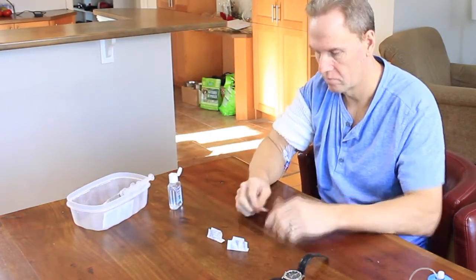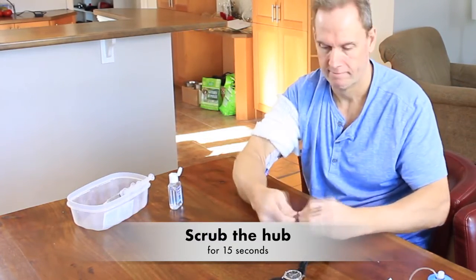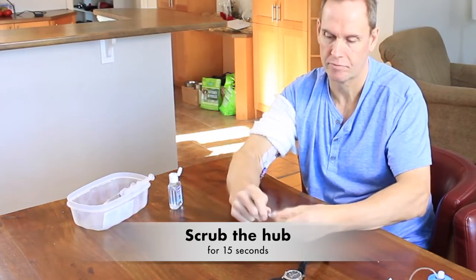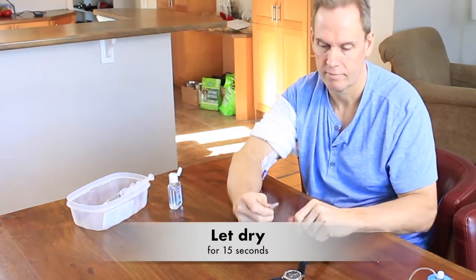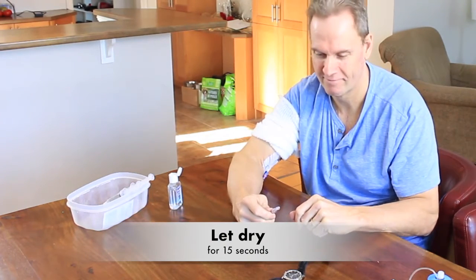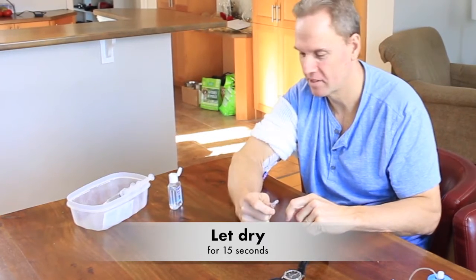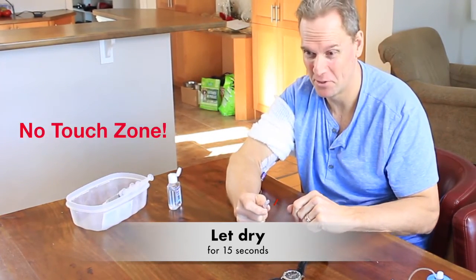Now, of course, you have to scrub the hub before you attach your flush. So scrub the top and the sides of the IV cap for 15 seconds. And now let it dry for 15 seconds. Remember, this is a no-touch zone. Nothing can touch the clean end but the tip of the flush.